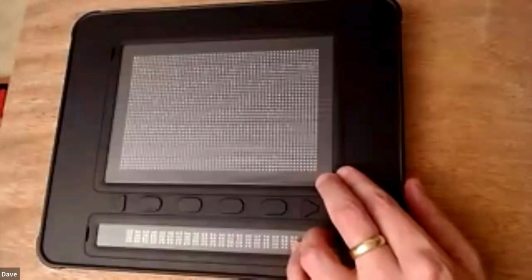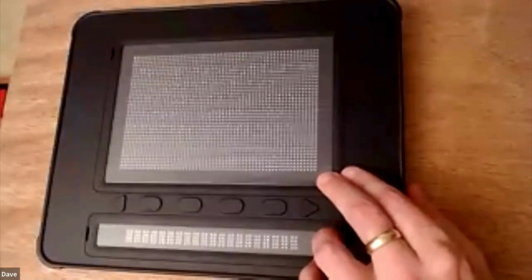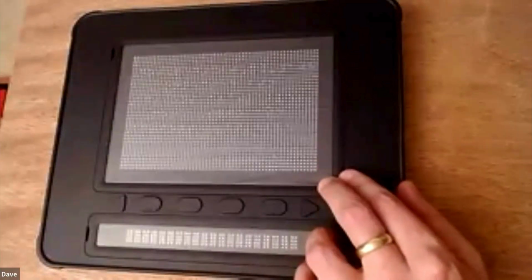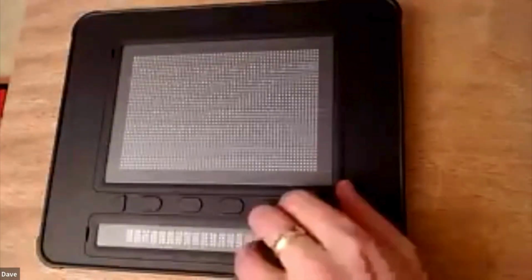And we supply spare cell protectors. We don't expect you to need to change it. Most people have been using their cell protectors for many months, and in some cases even over a year. But should you need to replace a cell protector, well, we give you 3 spare cell protectors in the box, and if you need more, just give us a shout and we'll try and help you out.